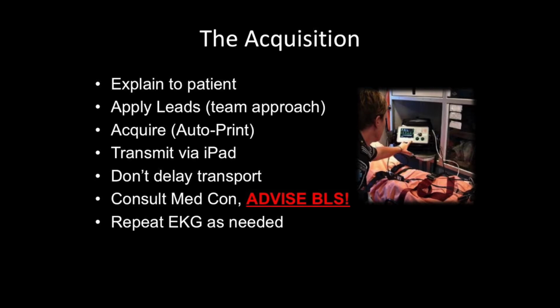Consult medical control. This is key, key, key. I'm very worried that they hear 12 lead and assume you're paramedic level. Make sure they understand we're not paramedic level. We're sending you an EKG, BLS 12 lead, whatever, BLS unit, right? Make sure somehow you get that in there, probably at least twice, because they have a lot going on, right? And repeat the EKG as needed.